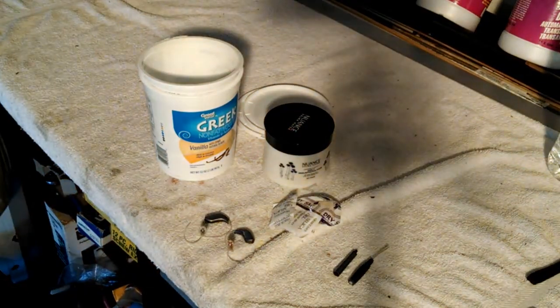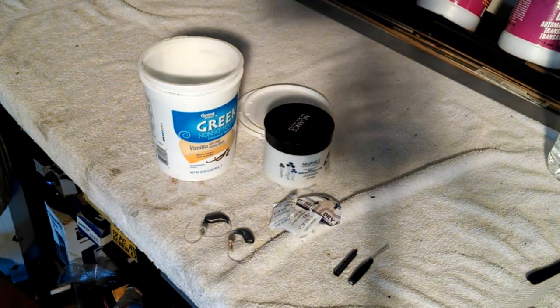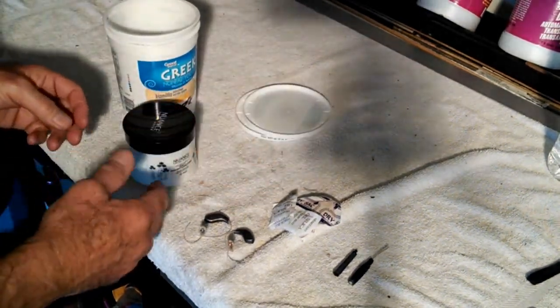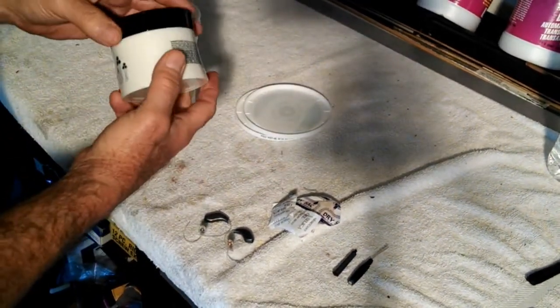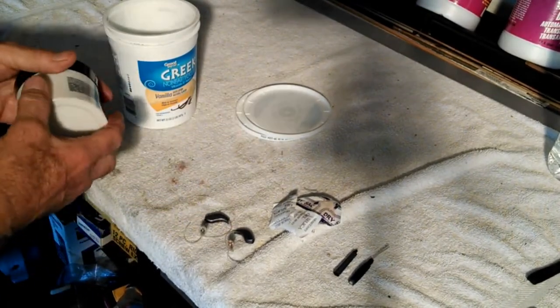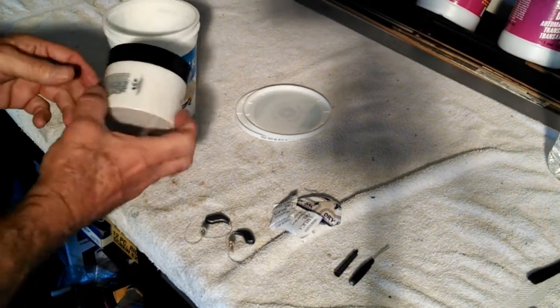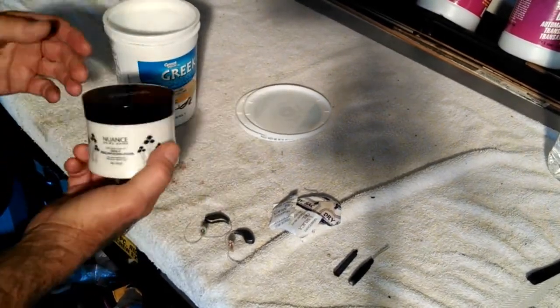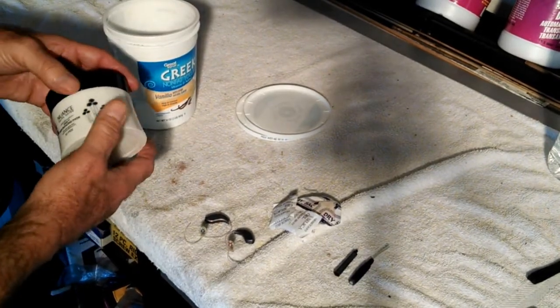Hi guys and gals, Froggy here. What I'm going to show you how to do today is to make your own hearing aid desiccant dryer system. They sell for about 10 to 20 bucks on Amazon or eBay, but you can make it yourself and save 10 to 20 bucks. It's pretty easy.